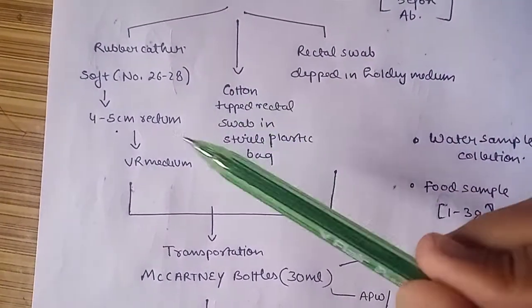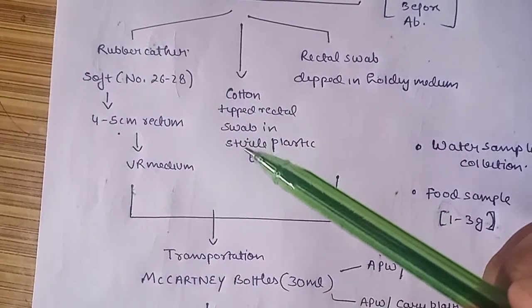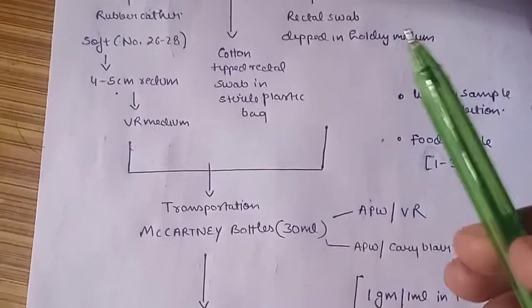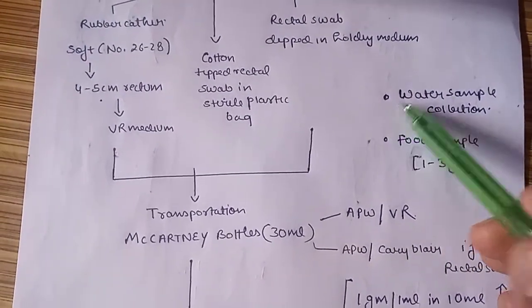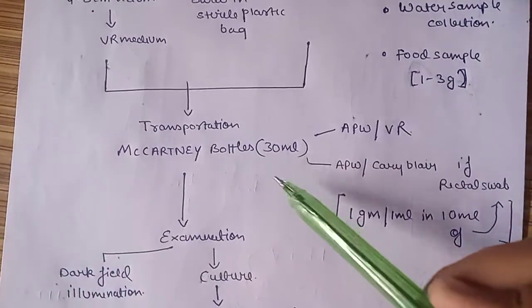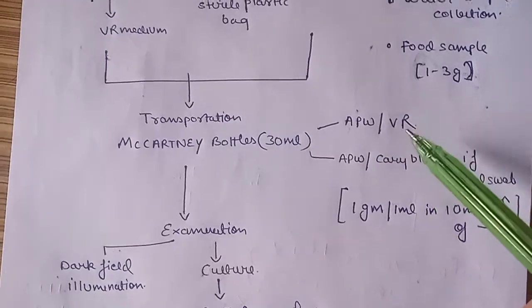But another method where both of these are not available, means the holding medium is not available, is that we do cotton tip rectal swab in a sterile bag, and then after collecting the sample of the stool, we do also collect the sample of water of the suspected area and the food sample which is suspected, and then this all is transported through McCartney bottles that are around 30 ml, and these bottles contain alkaline peptone water or VR medium.